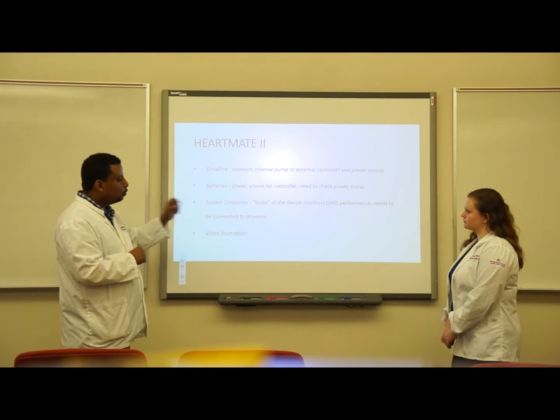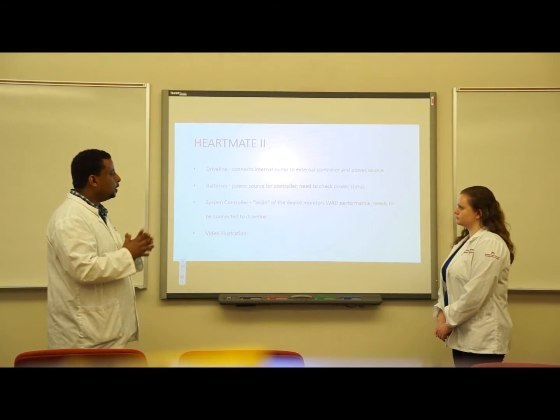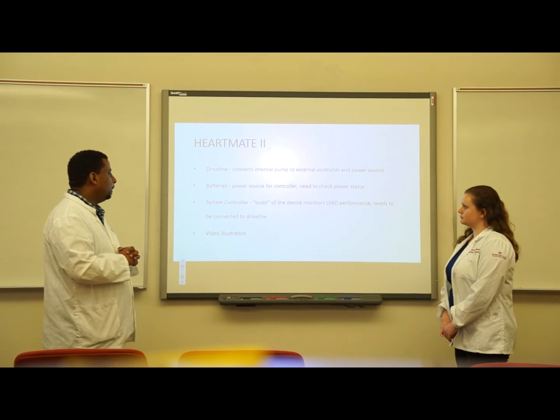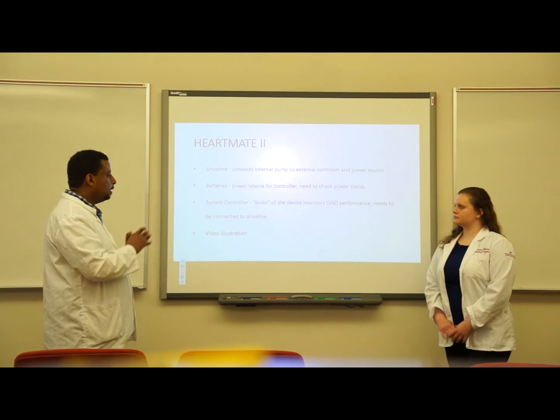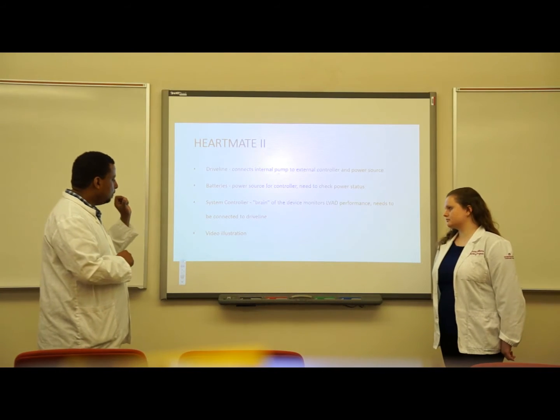It has a system controller. The system controller is known as the brain of the device. It monitors the performance of our device, and it needs to be connected to the drive line all the time.